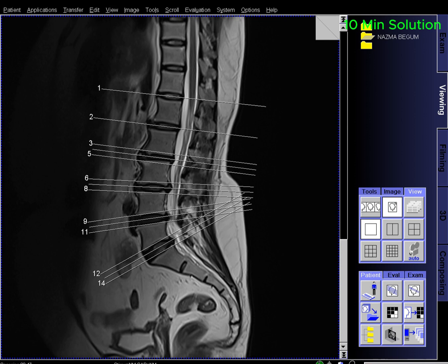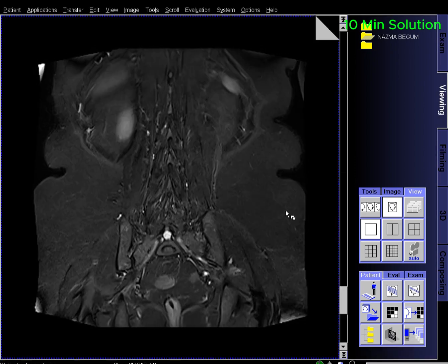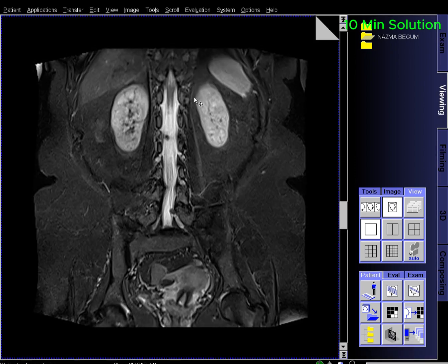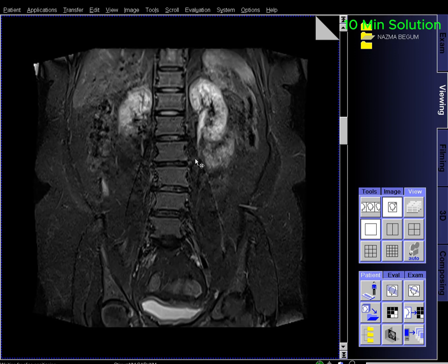Evaluation or monitoring of tumor of the CNS or meninges. Investigation of any cause of spinal disease in pregnancy. Evaluation or monitoring of spinal cord compression.